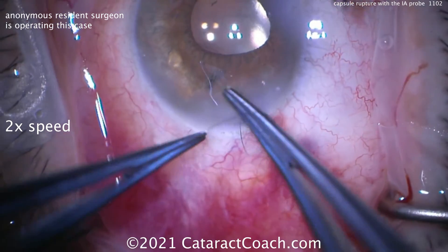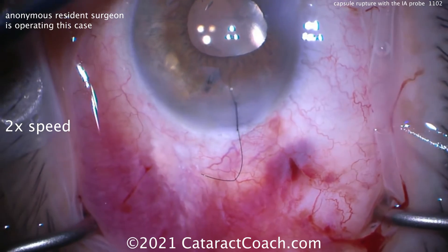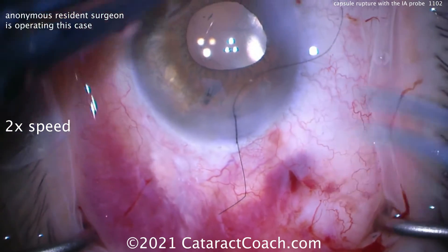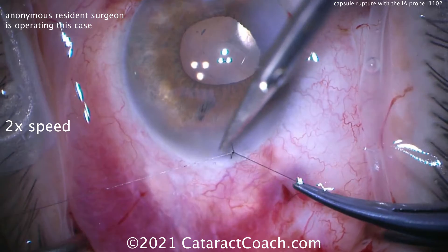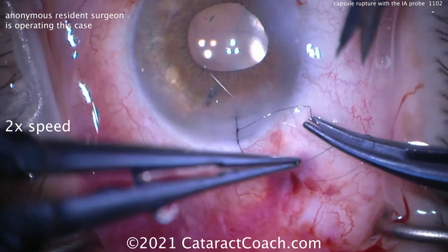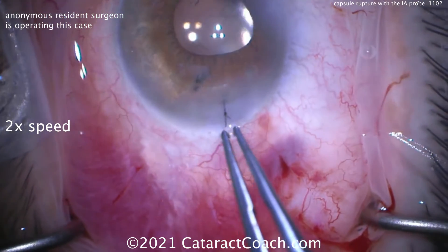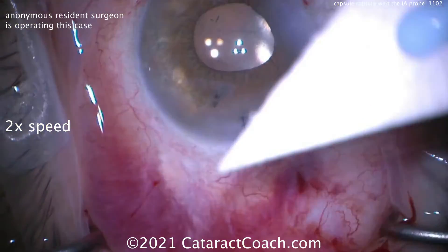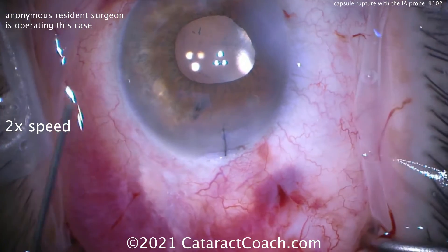We've got to be good at suturing as well — cataract surgeons can't be sutureless; you have to know how to throw a suture. That looks like a nice pass. Let's get the tension right. You may want to adjust the IOP and make sure the anterior chamber is at normal tension, then just tie this up. That looks nice and square — one more knot, and that can be buried. We pull the knot back and forth to see the tension. That looks great, and this patient had a beautiful outcome. There was a break in the posterior capsule during cortex removal with the bimanual IA probe, but we were able to finish the case beautifully. Nicely sealed incision.